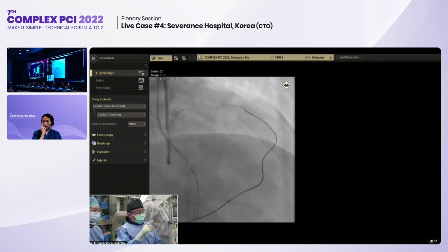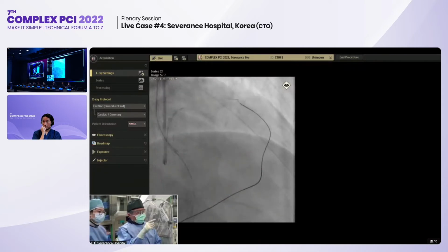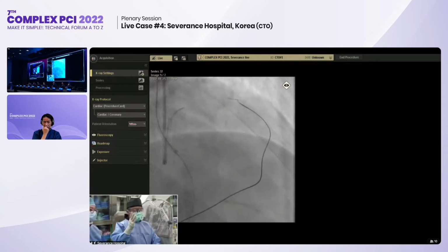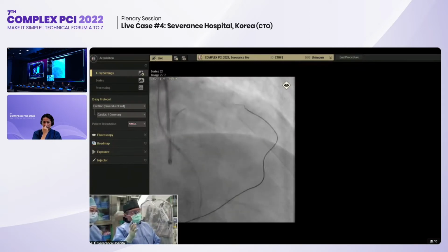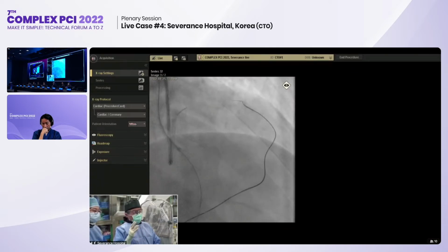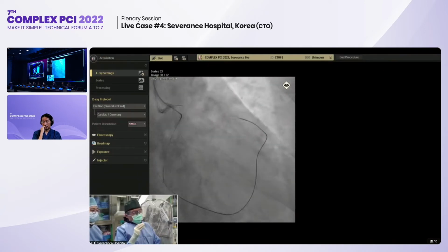Yeah, so you can see some middle portion was bended, meaning the distal cap. Yes, we can know from the CT scan. Also, the distal stump has some calcification, really a half moon, full moon case. Okay, next one. So antegrade preparation again with the caudal view.